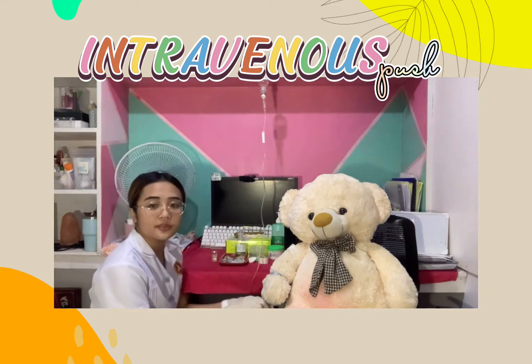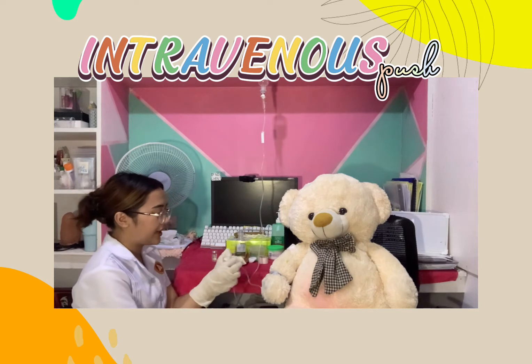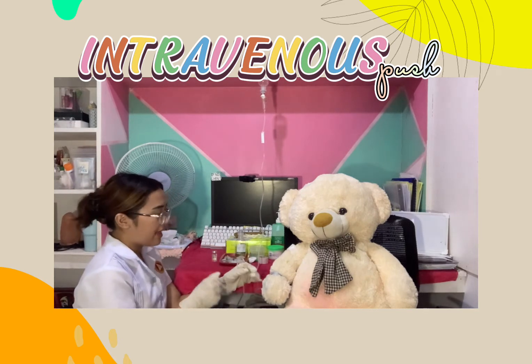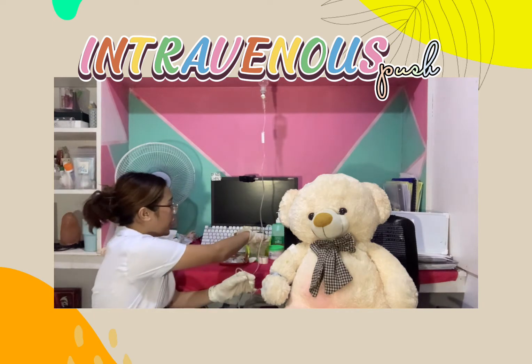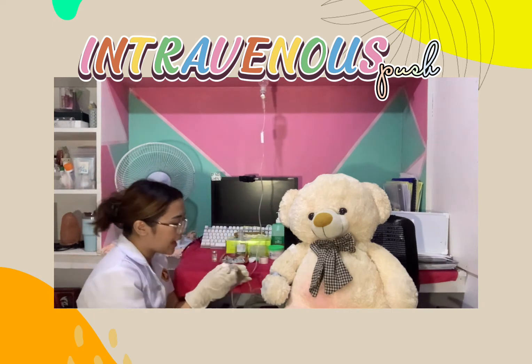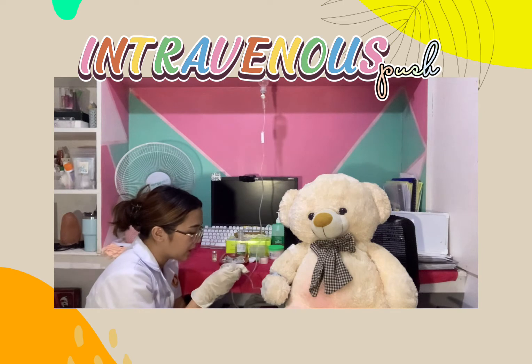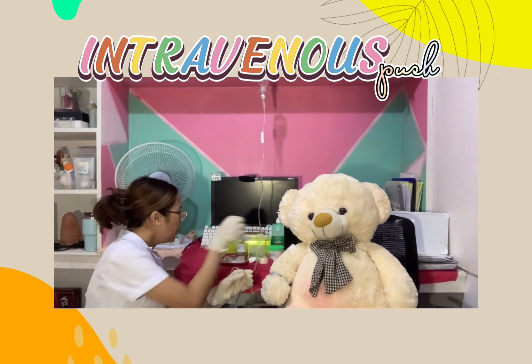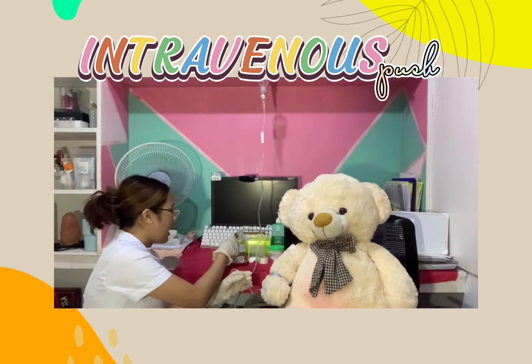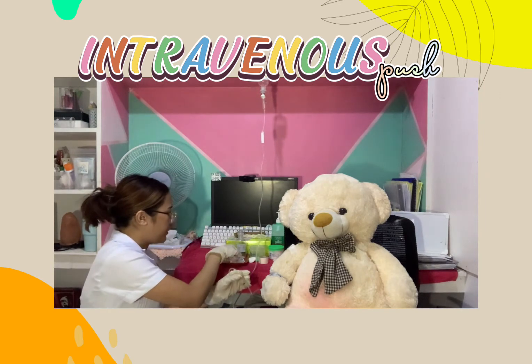So, in here, we will look for the injection port. And then, when we already locate the injection port, we will clean the areas of the injection port, starting from the center, going outwards in a circular motion for 10 seconds. And then after that, when it is already cleaned, we can now administer our sterile water.